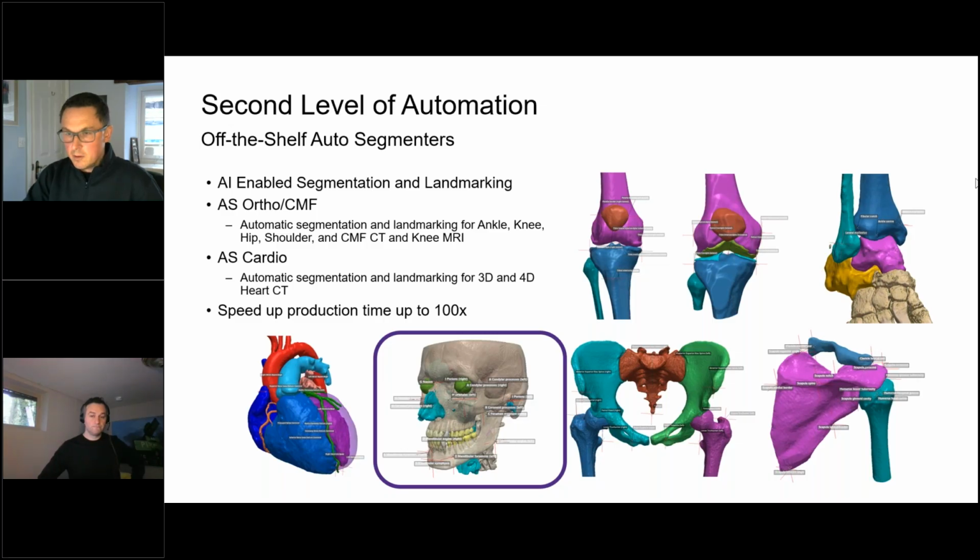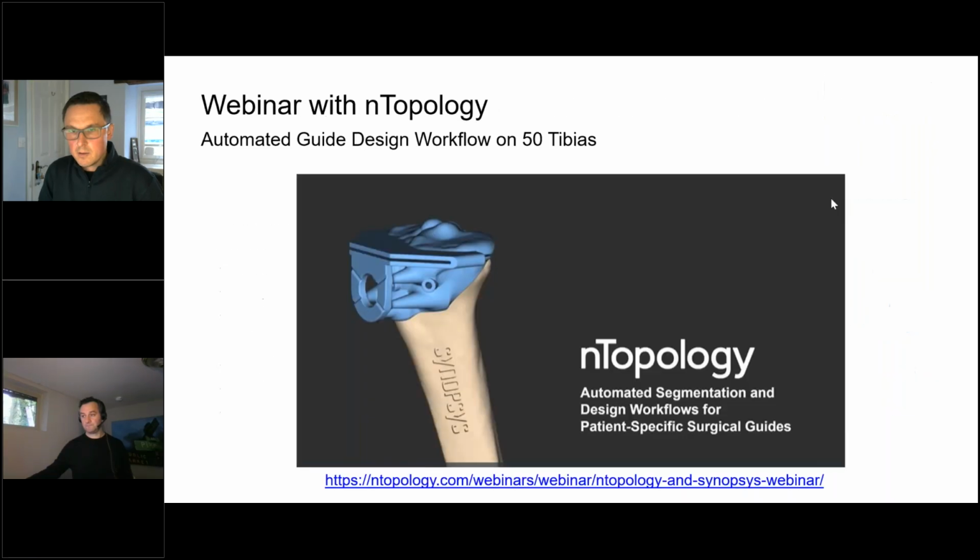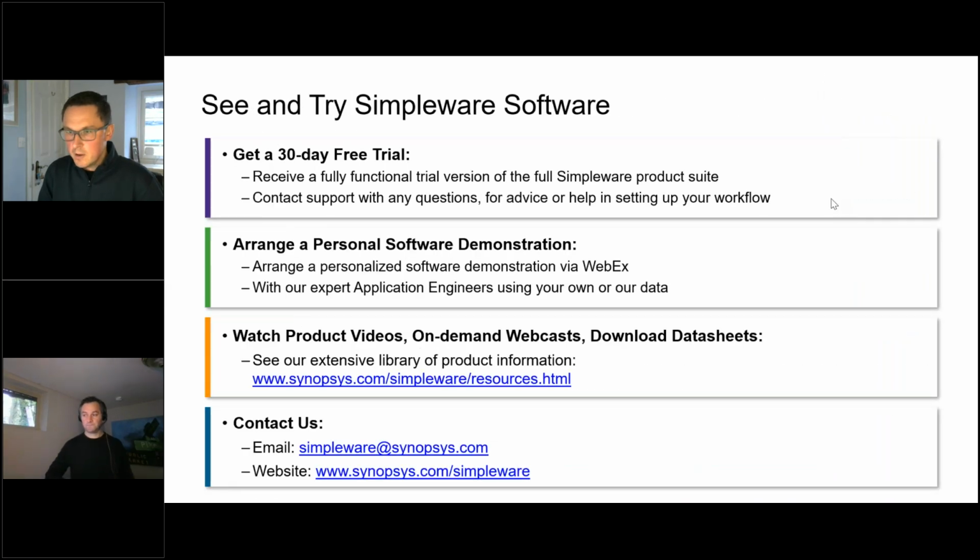Yes, assuming it's a standard CT scan like the ones you can see on the screen here. It doesn't have to be 512 by 512. Again, maybe there are some other things, like the Hounsfield unit calibration, that can sometimes cause some differences, but again, best thing is to try it out and let us know how it goes.